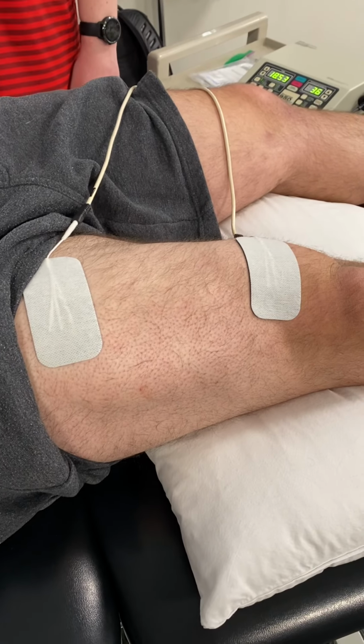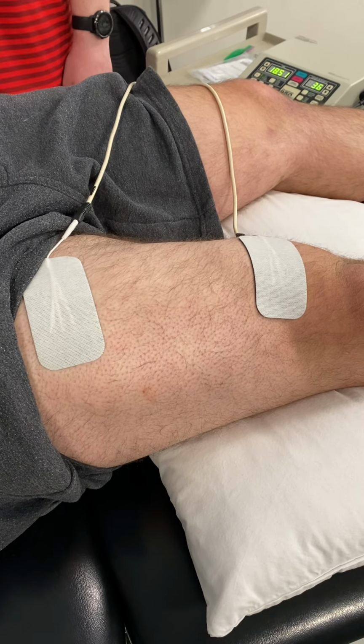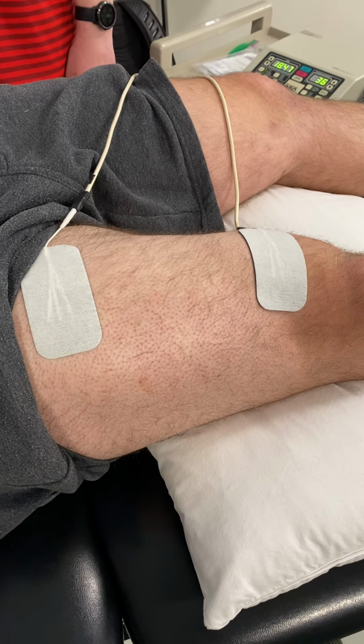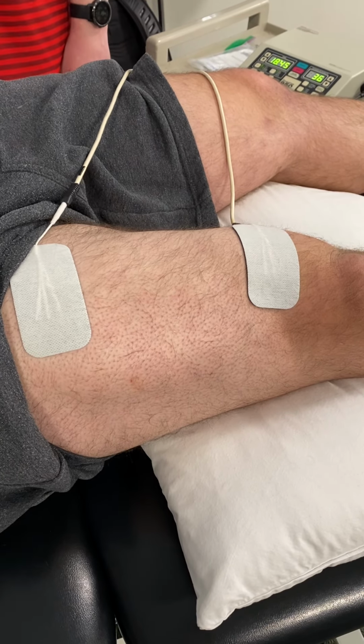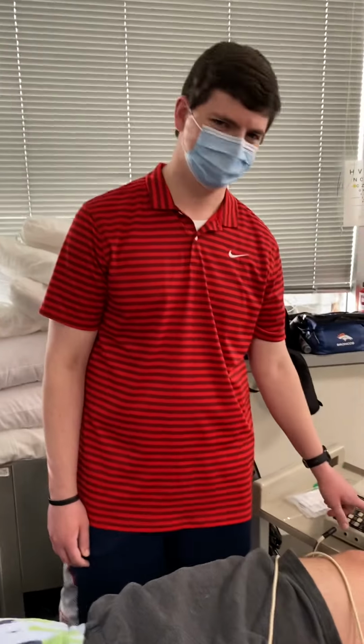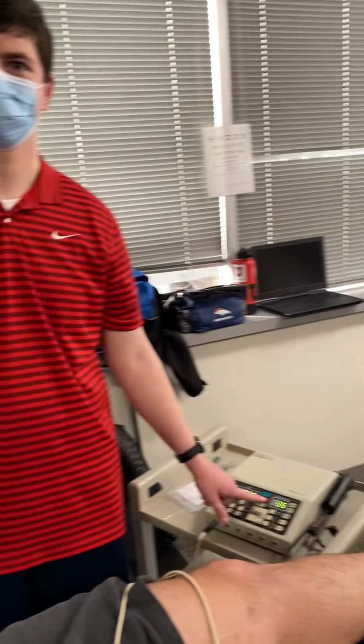I was thinking that we would do some electrical stimulation to your quadricep muscle because you've been having issues getting it to contract and it just feels generally weak, right? Right. Okay. And then so relax. I think we do some electrical stimulation and basically I put these electrodes on you.